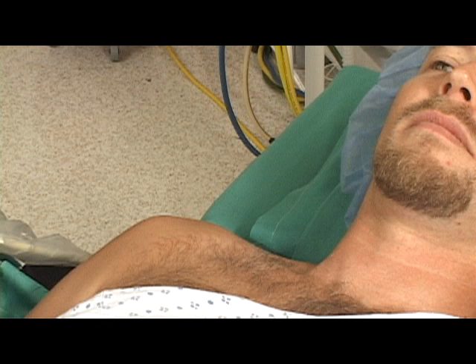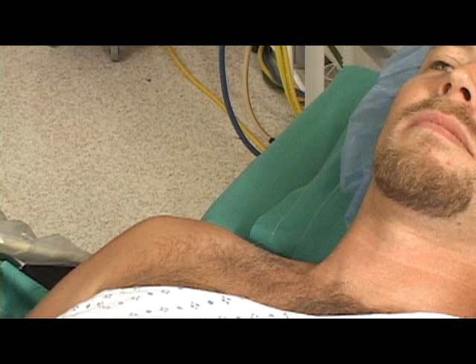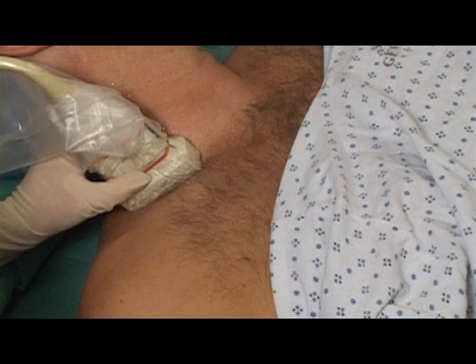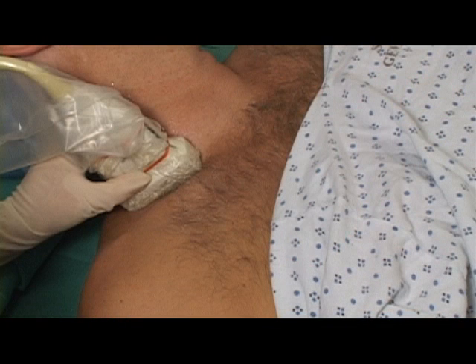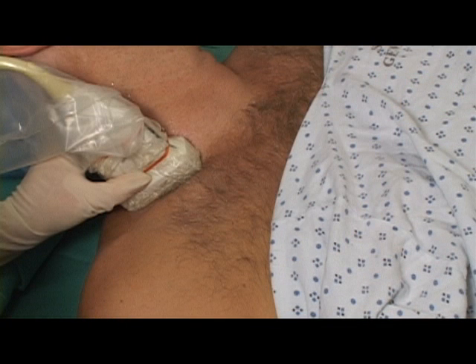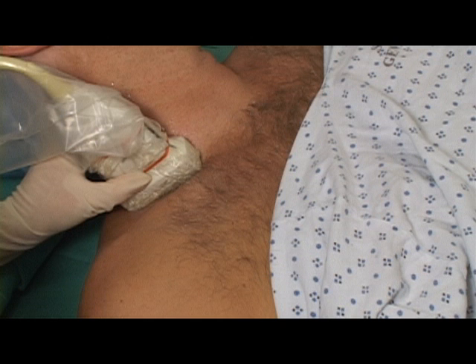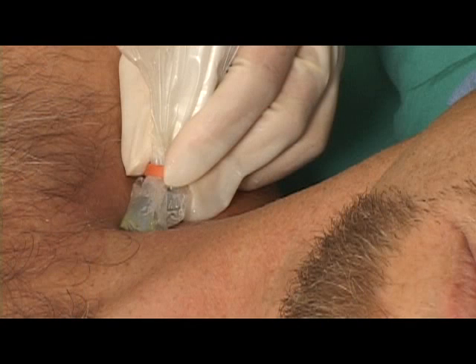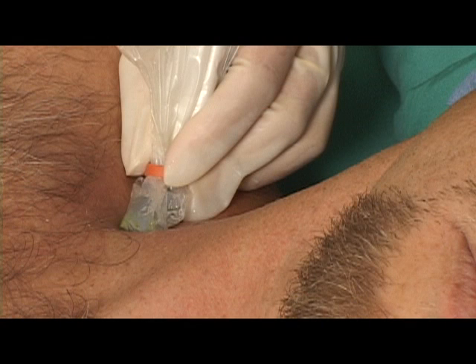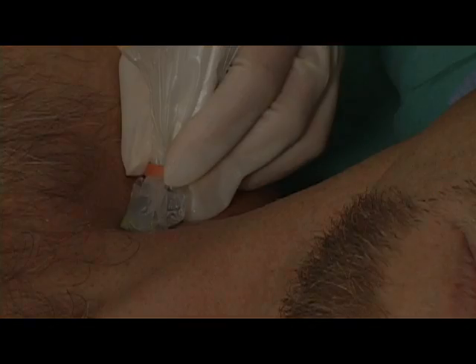Interscalene and supraclavicular blocks of the brachial plexus are often performed for shoulder surgery and procedures of the upper extremity. Because ultrasound imaging blurs the distinction between these two blocks, both will be discussed together in this video.